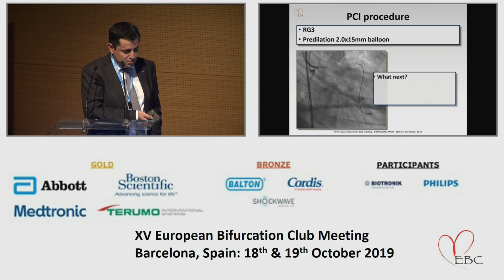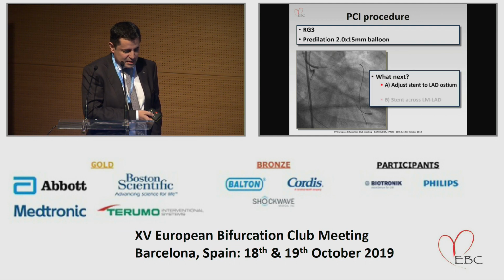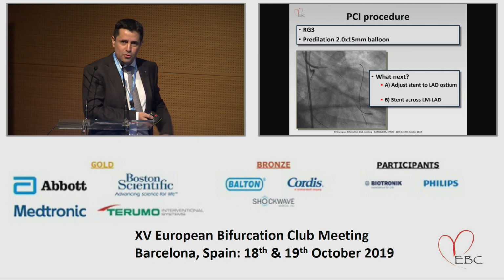If I may ask the audience, after seeing this angio: how many of you would adjust the stent to the LAD ostium? How many of you would stent across the left main to the LAD? If anybody could click just on the video, just to let the audience express their opinion about the strategy.